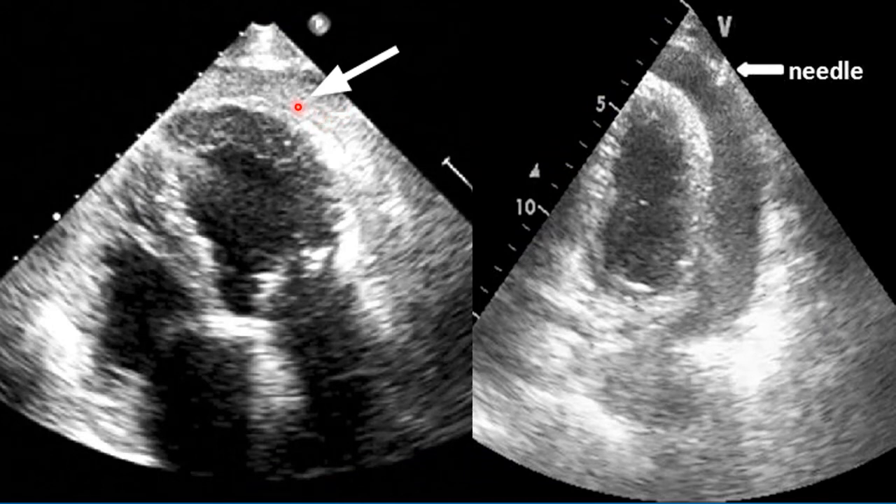This is an example using echo contrast. The pericardial fluid, rather than being black, is now filled with tiny little bubbles which can be seen to move around. I find that using a colloid solution like Volplex creates very good bubbles with half a millilitre of air. If you can't get hold of a colloid solution, a little bit of blood and saline with a little bit of air will do nicely. Get somebody else to create the bubble contrast for you — don't try to do it yourself. You can inject it through the needle or through a four-French dilator. This is extremely helpful if you don't have access to X-rays. If you put a four-French dilator in, your position is secure and you have all the time you need to create your bubble contrast solution and confirm location before you put the drain in.